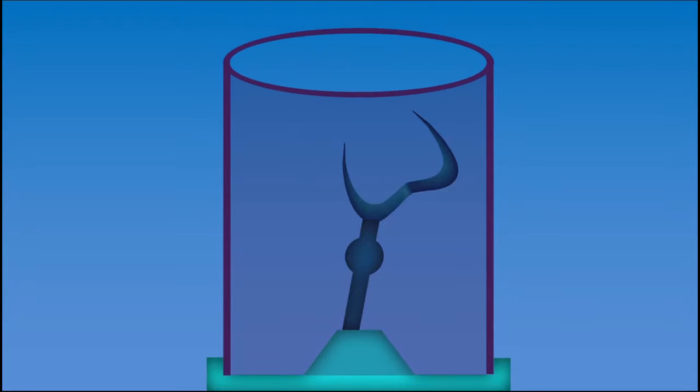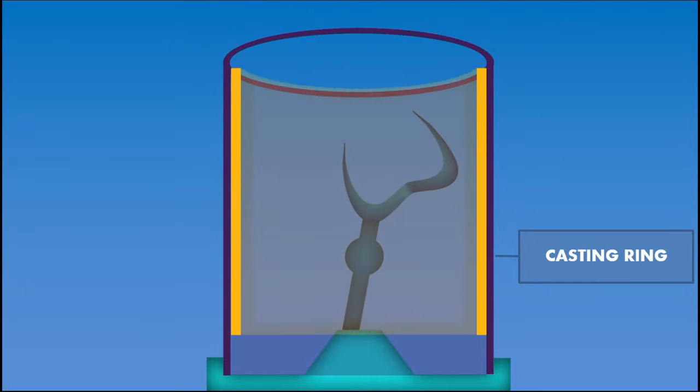Once it is aligned, a casting ring liner is placed inside the casting ring. This casting ring liner will get burned out along with the wax during the burnout process. This will create some space which will be utilized for expansion of the investment. All metals when solidified from a liquid state will undergo shrinkage. This expansion of the investment is essential to compensate for the metal shrinkage.